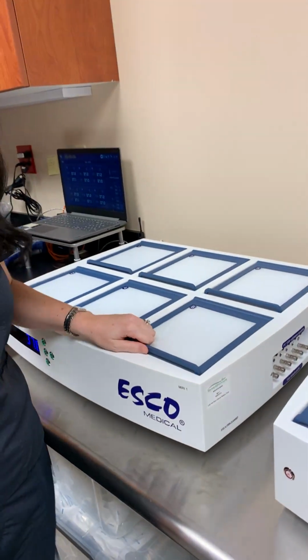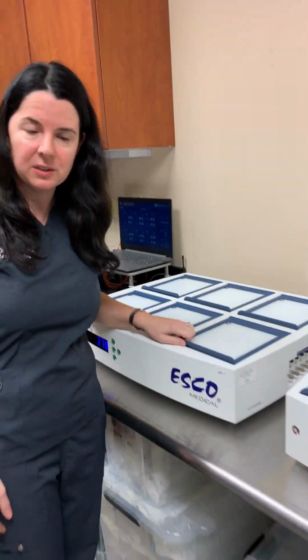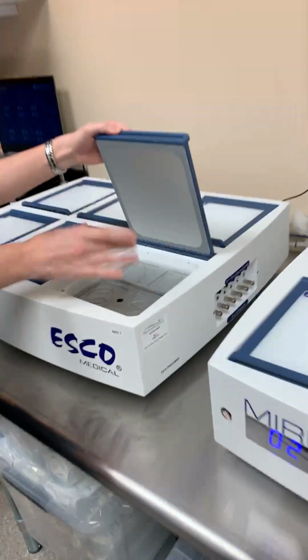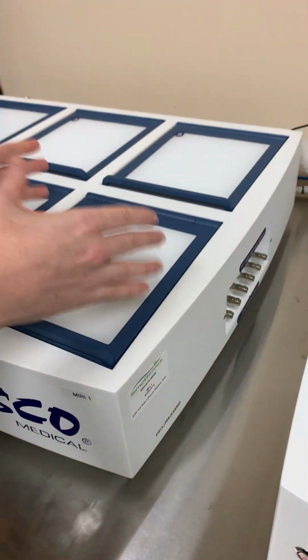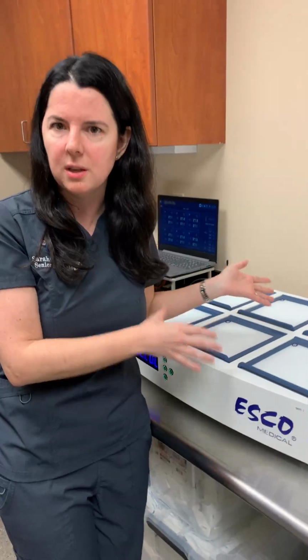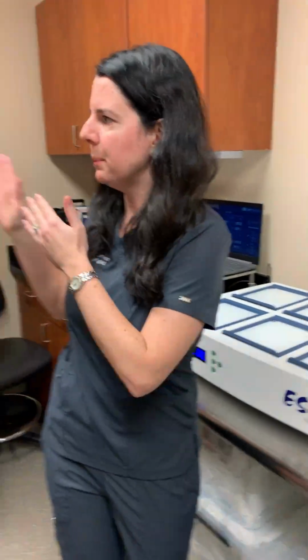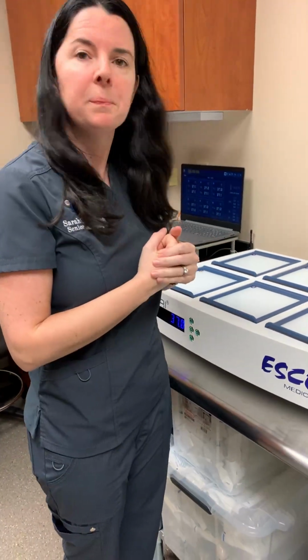They are really different. And what's the difference between these and the old ones? Julia was running some tests on them before we go into cycle, but these are one compartment per patient. So we can open and close a compartment. There will be culture dishes inside here. That way, when we open just this patient, we're only affecting the gas in just this patient. The rest of the patients in the incubator are safe.